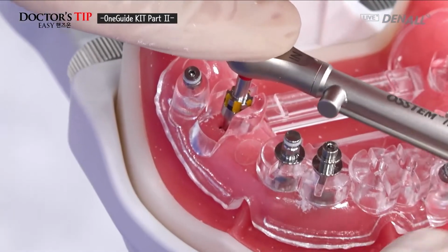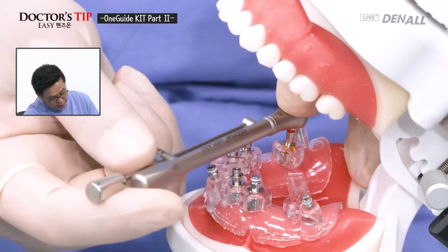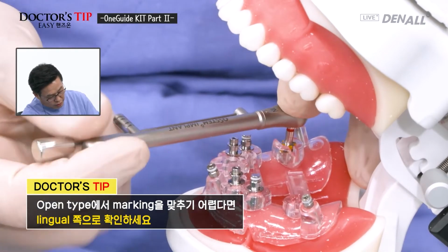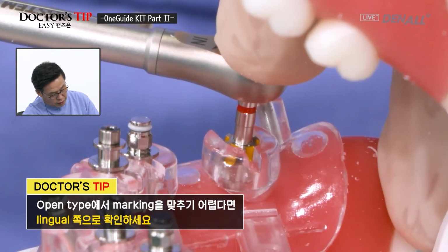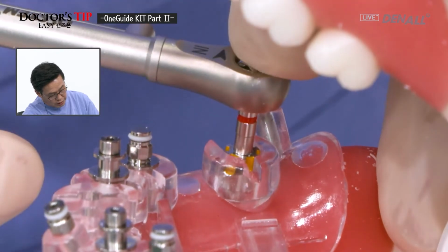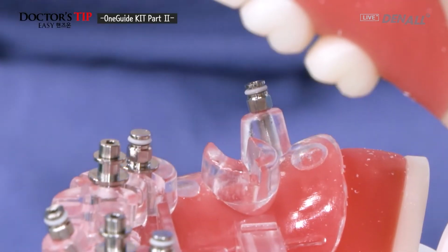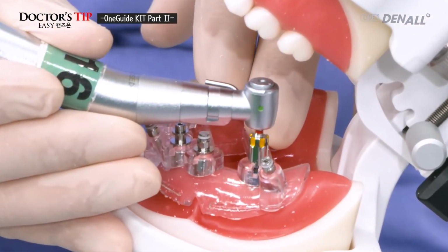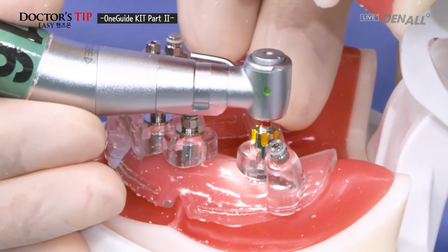As you can see, this is open type. If you cannot see very well, you can look at the lingual side of the opposite side and check and get the accurate position. And on number 36, implant is being placed.